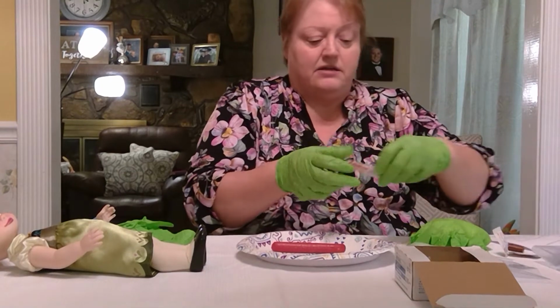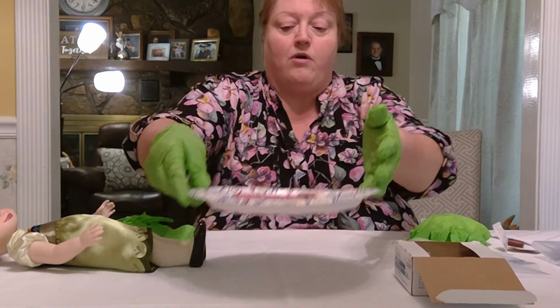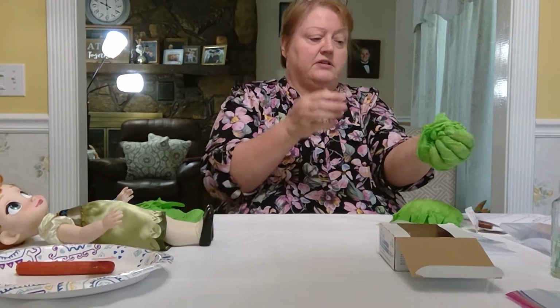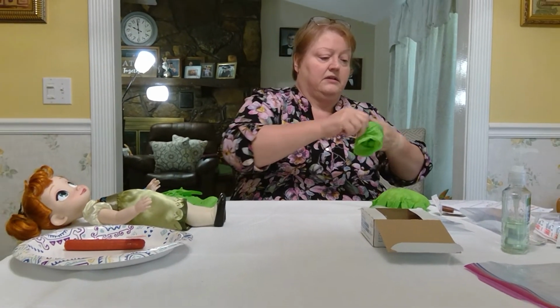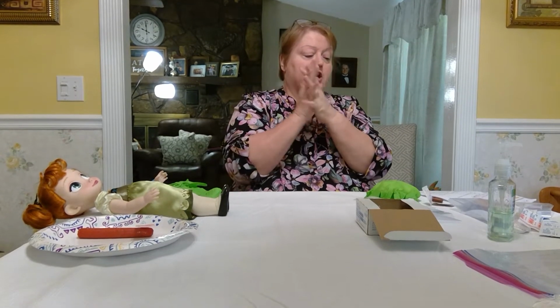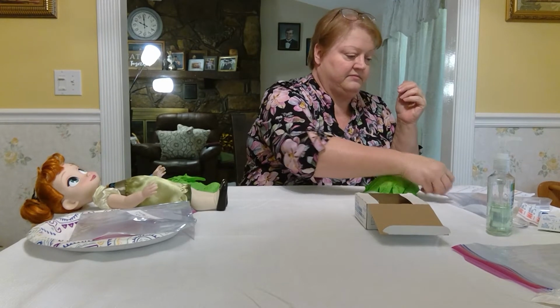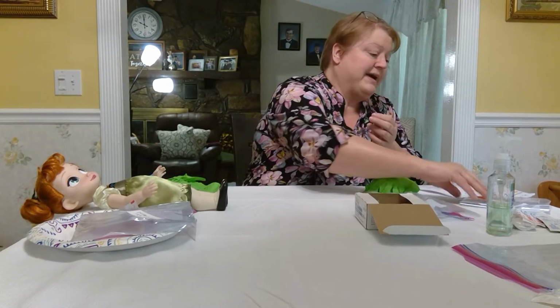Apply a Band-Aid to the area. And now you're ready to go on to the next injection. Change your gloves, taking them off correctly. Hand hygiene. Now you're ready to go on to the next injection. Now I'm going to give my insulin.